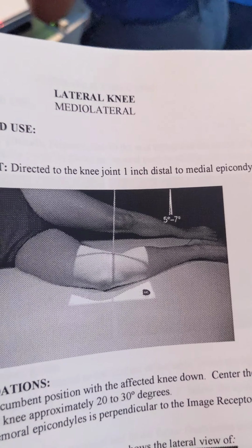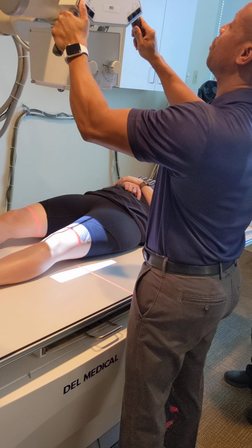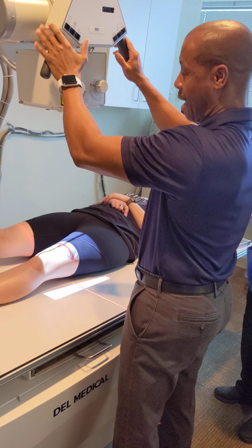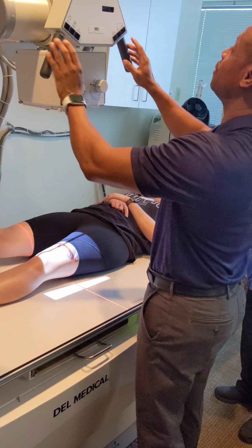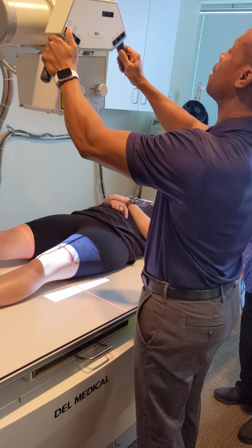Patient is going to lay on their side. Now, there is an angulation for your lateral. It is going to be 5 degrees toward the patient's head. Okay? That is standard. I've already angled it 5 degrees. A little too long. Come back a little bit. All right.